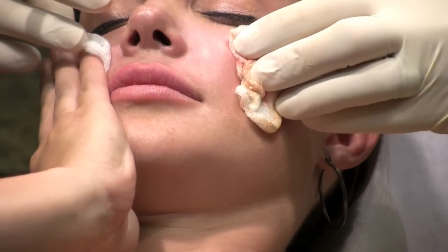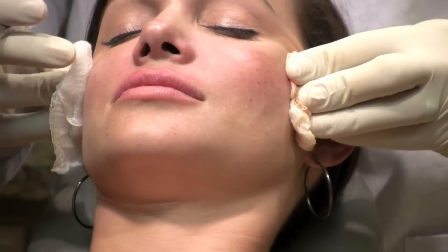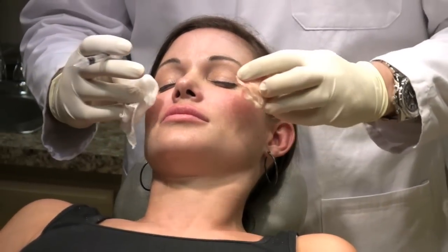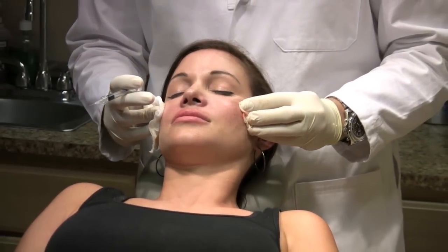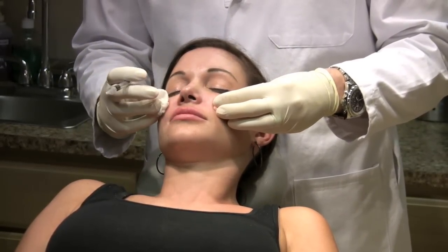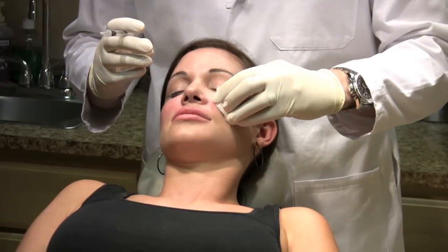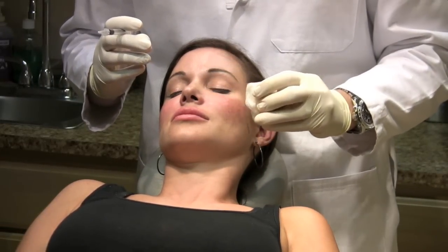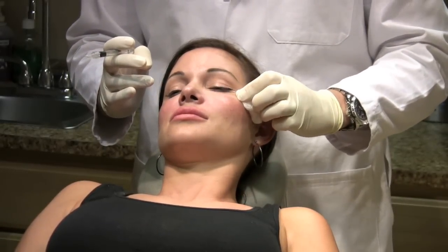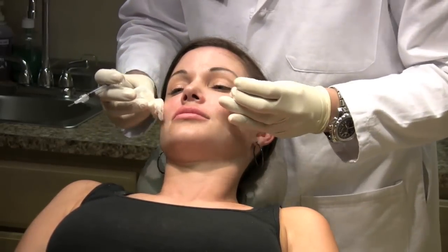So now I come on top. I'll get this from you. And this is the best view to be able to tell symmetry. I want you to be aware that 85% of people have significant facial asymmetry from one side to the other. Jennifer's not an exception. So you want to be aware of those asymmetries to start with and not accentuate it. You can try to make the face more symmetric, but you certainly don't want to accentuate the asymmetries. And this view really tells you where the fullness, where the height of the malar eminence is. Like I said, I like to keep a little bit just for fine tuning.